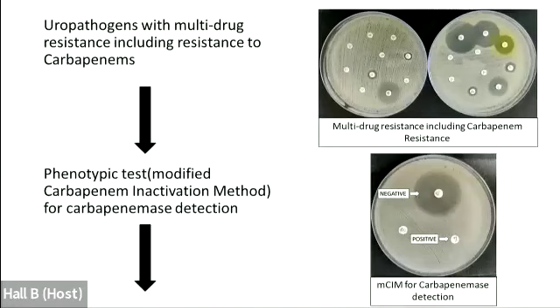So the methodology was that first we processed the sample, then once the isolate was confirmed to be enterobacterial, we performed antimicrobial susceptibility testing using the Kirby-Bauer disc diffusion method. And if the isolate was found to be resistant to most of the antibiotics plus resistant to carbapenems, then we processed further. We then detected if it was producing any carbapenemase enzyme. For that, we used the modified carbapenem inactivation method recommended by the CLSI.